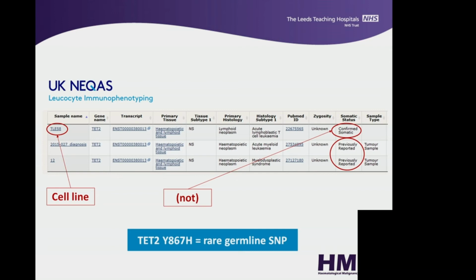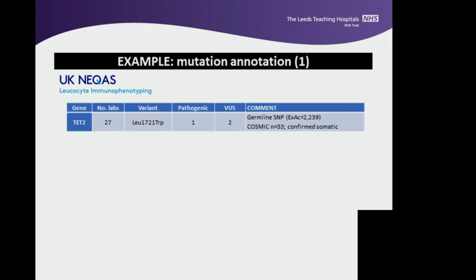And that's how this has become quite a dirty database. You can see it's been reported many times in dbSNP databases. Again, there were numerous other versions of this on the same send out.